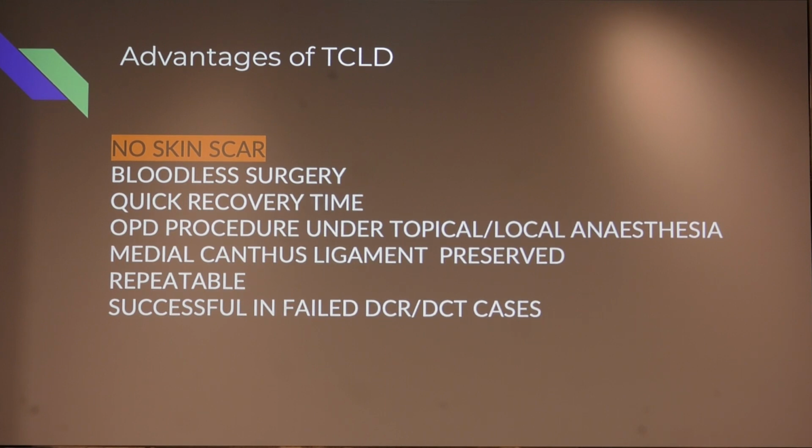I have enumerated the advantages: bloodless surgery, quick recovery time, OPD procedure. We use topical anesthesia. Medial canthus is preserved in the surgery. Repeatable: if one fails, we can repeat the surgery. Another advantage, we can use it in failed DCR or DCT cases also.